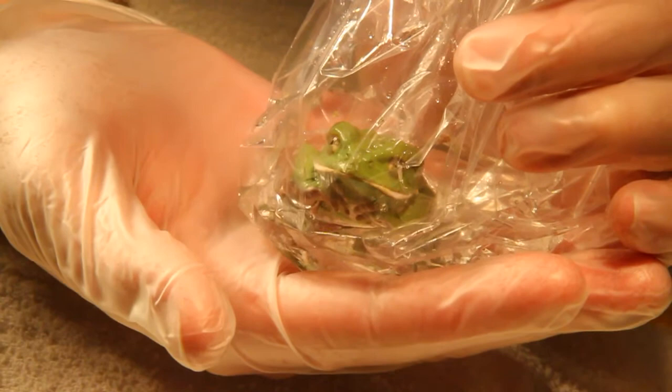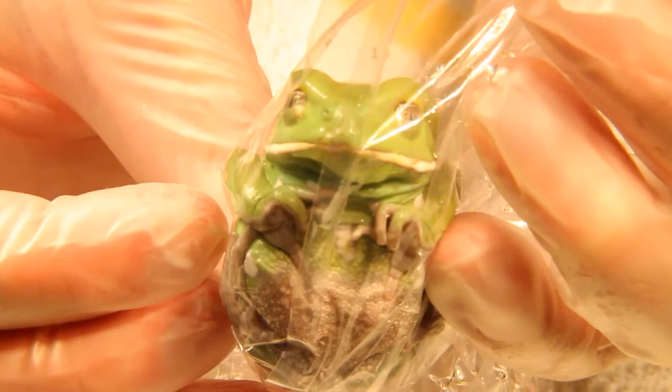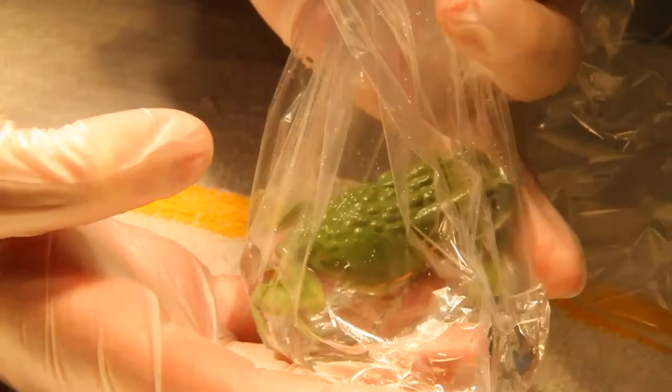Induction should occur within 30 minutes and often occurs in distinct phases. Ventral erythema is usually the first sign. Here you can see erythema beginning on the feet of this frog. An excitement phase often follows, and the degree of excitement may vary with the species. You can see here that the plastic bag is useful to help prevent injuries during this phase. Next, the righting reflex should be lost; prior to this stage, the animal would not tolerate being placed on its back.